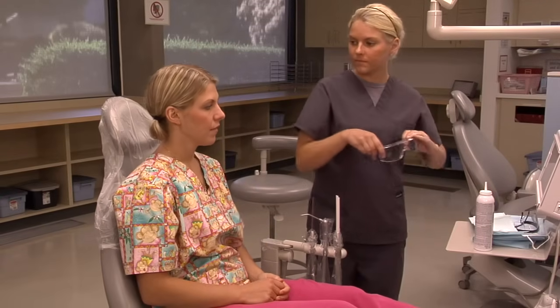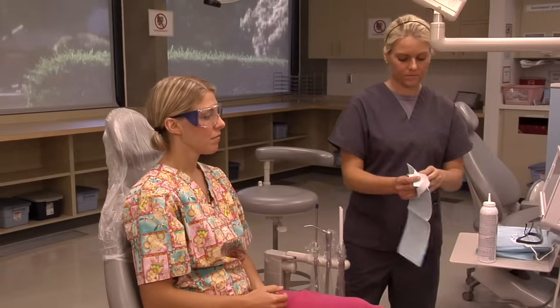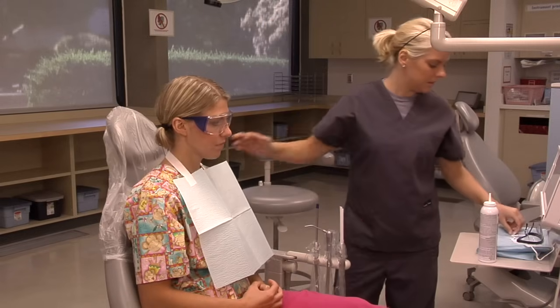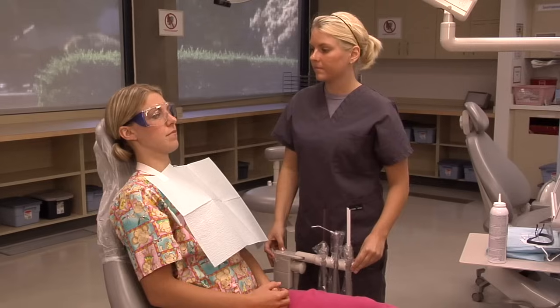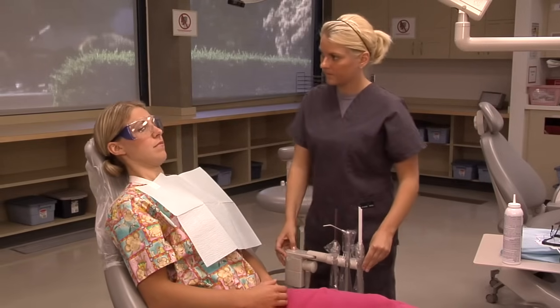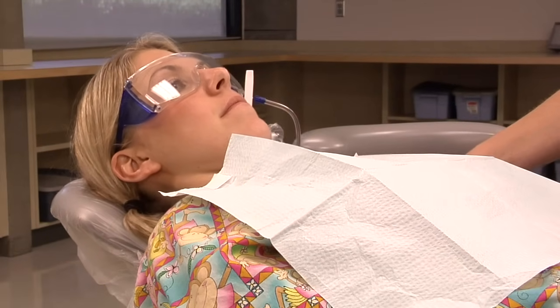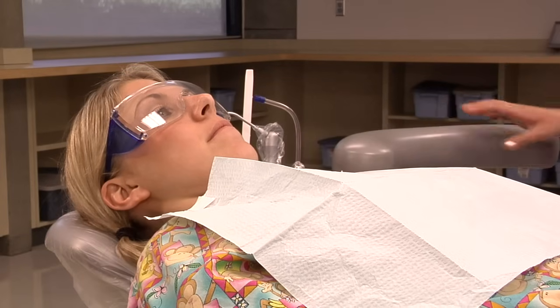After seating your patient, provide them with protective eyewear and place their protective bib on. Now place the patient into a supine position and arrange your dental assisting chair in the correct position for the suctioning procedure.